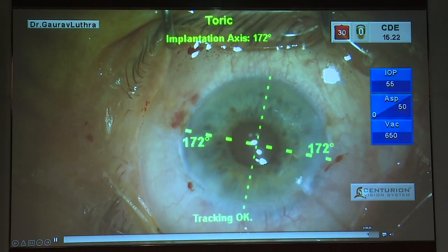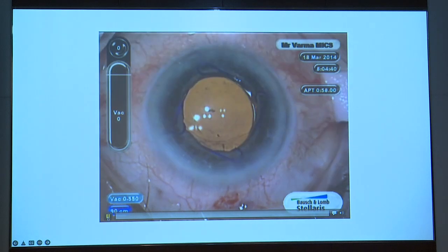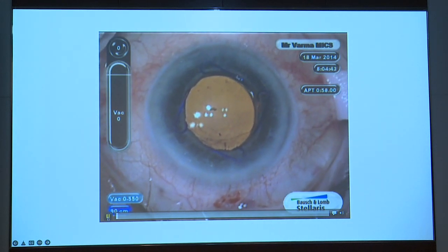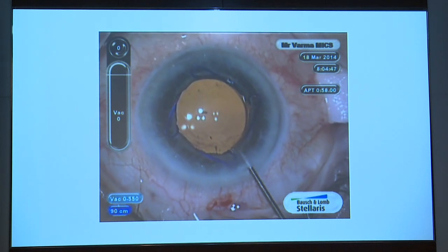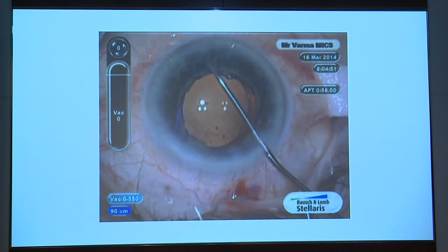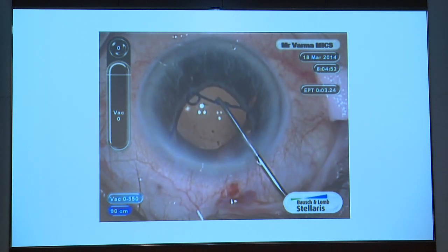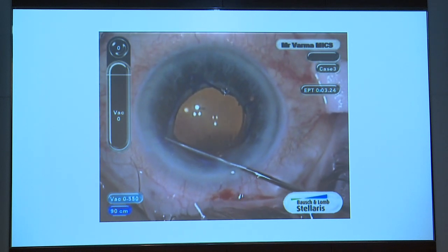So let me finish by showing you a disaster from the Malugins ring, which one of my friends shared with me for my course, which is the Lord of the Rings in the SCRS. And this gentleman is practicing in the UK, and he is also a fan of the Malugins ring. After finishing off with the surgery, he decided to remove the Malugins, and as you can see, as he's trying, it's a very atrophic kind of iris.